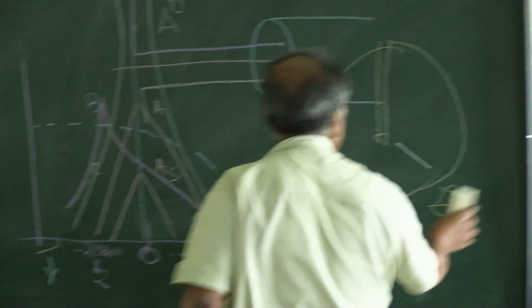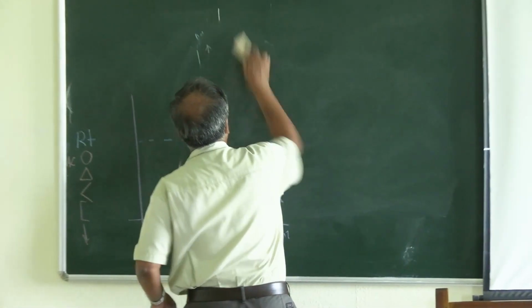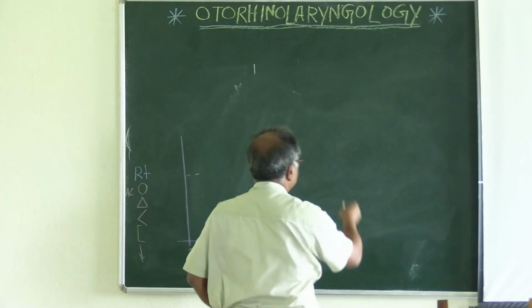Now, the main test is not the impedance. The main test, the difficult part of that, is the acoustic reflex. Acoustic reflex. Now, sometimes the question has come to draw the neural pathway of the acoustic reflex.